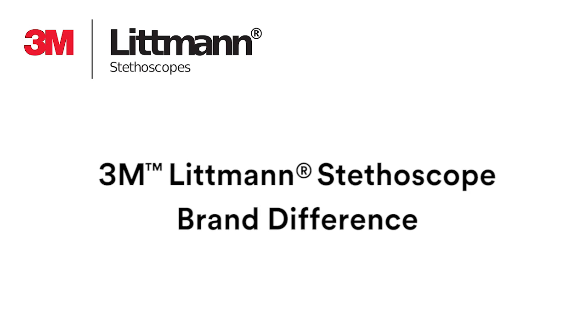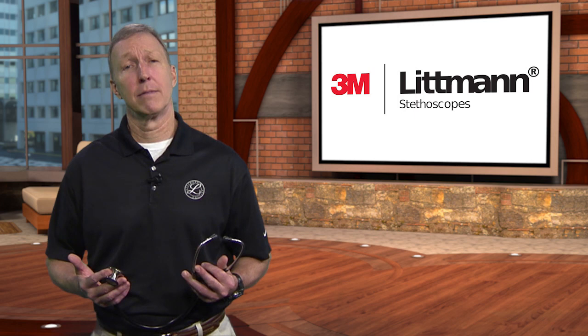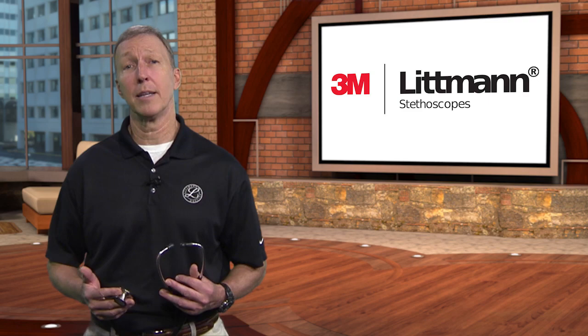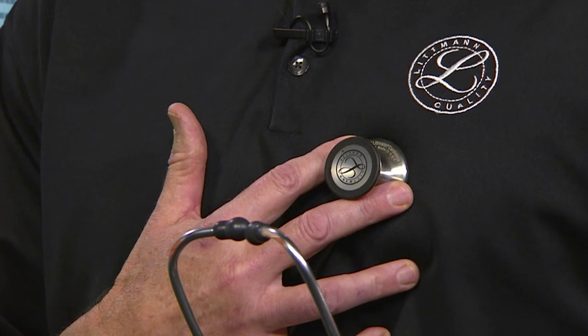Littmann stethoscopes have a tunable diaphragm technology, a 3M invention that helps make auscultating the patient easier and more effective. It lets clinicians hear different types of sounds by adjusting the amount of pressure applied on the chest piece. For low-frequency sounds, rest the chest piece on your patient's chest. For higher-frequency sounds, apply a little pressure, creating a small indentation, and that will shift your stethoscope to higher frequency sounds. Press firmly and lightly over your chest to test for yourself.